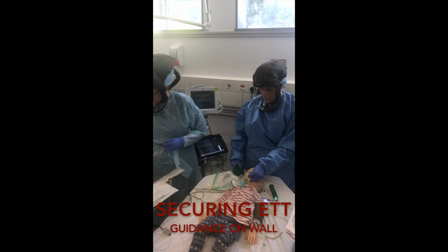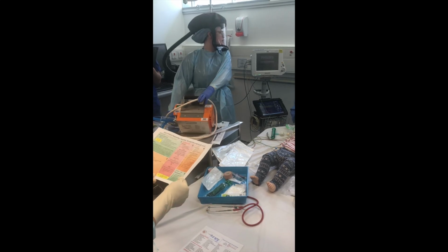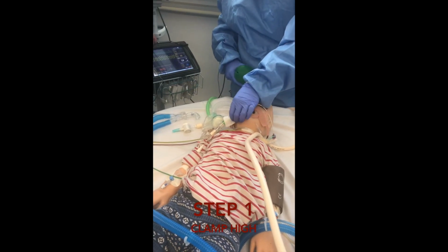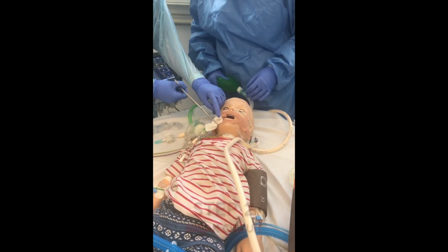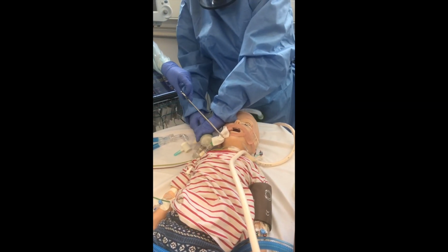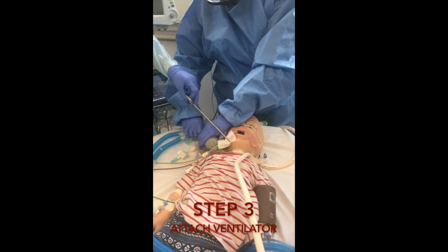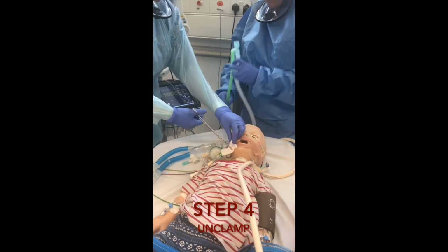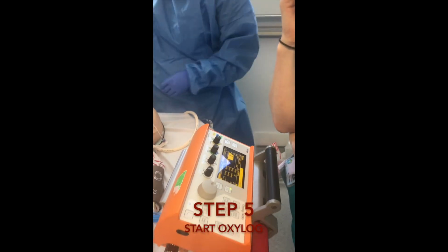Secure the ET tube, please. Always clamp the ET tube before breaking the circuit. Just go around the tube, as high up close to the patient as possible. Okay, so we'll be clamping there. Then we'll turn the oxygen off. Okay, that's clamped there. This has its own end-tidal CO2, so we need to keep that in. Okay, and that's gone. And we're going to unclamp now. So we've got a seal.